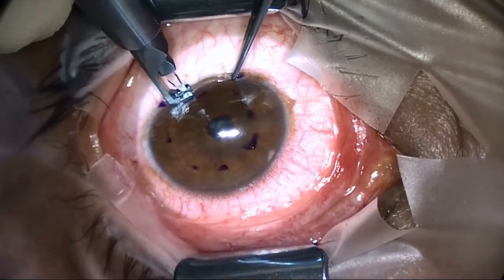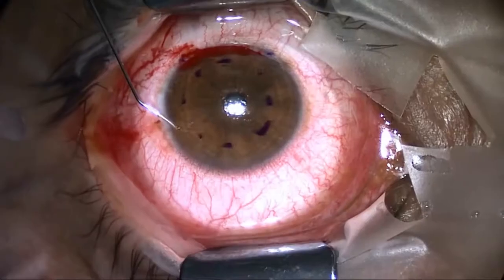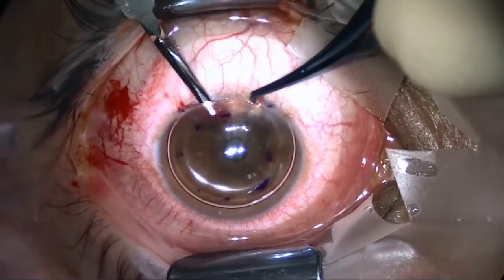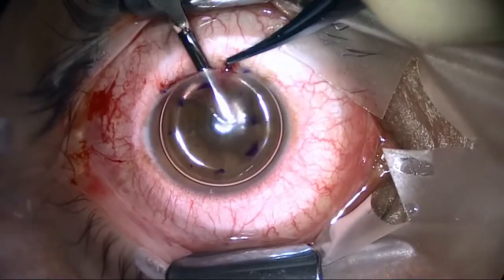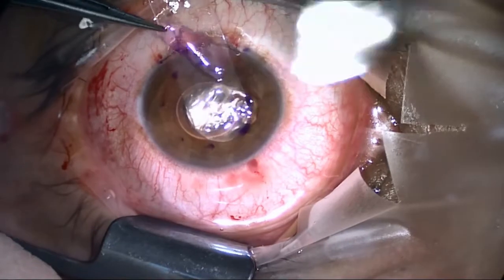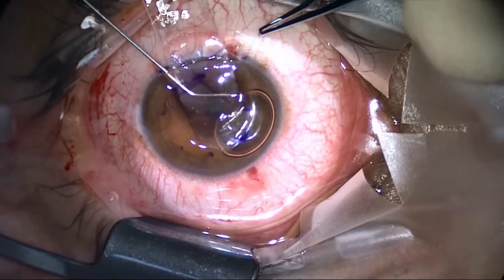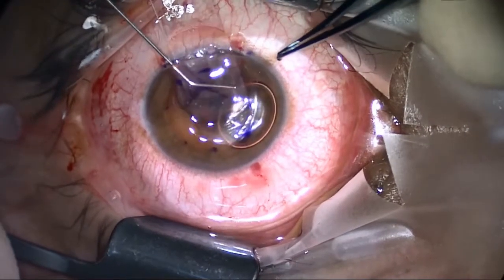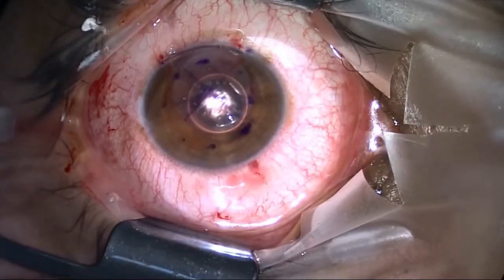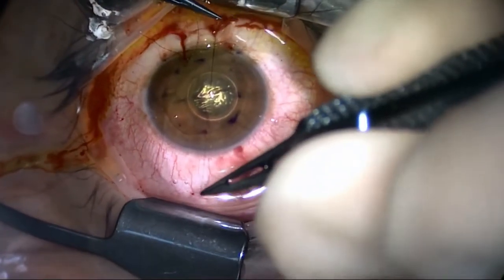The technique for the surgery is very simple. What we do is create a mid-stromal pocket of just over 7mm diameter. You can create this either with a femtosecond laser or with a manual dissection with a deep lamellar blade. We get a lenticle from the Gabauer GLC Expert, put it into this pocket, and suture it. There is also an option of cross-linking to try and stiffen it even further, but the actual technique is very simple.